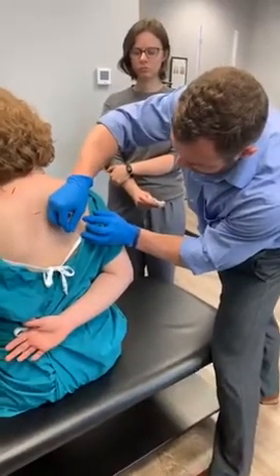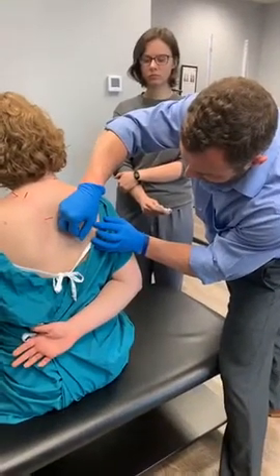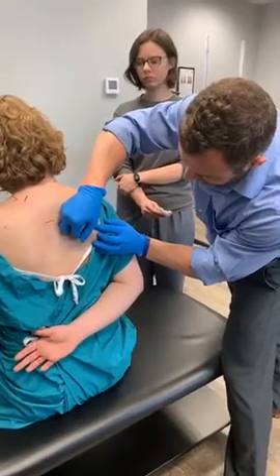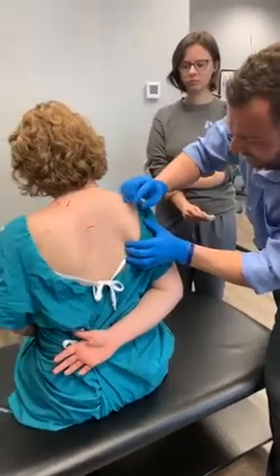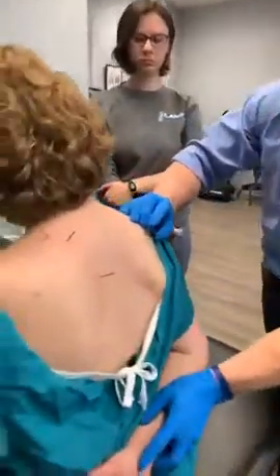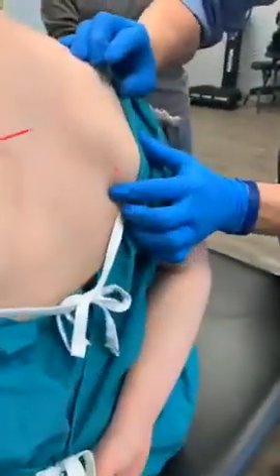Here we go. Tell us when you feel this, Lindsay. Okay. Right there. Right in the subscap here. Just let that arm relax. Just have it right there. There you go.